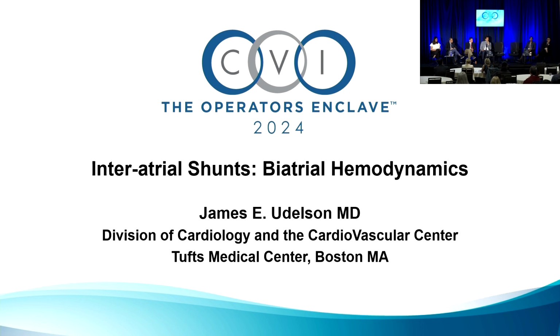Yeah, thanks so much for asking me an interventional question, Navin. I really appreciate that. So I assume, I don't know, but I assume in those other procedures that it's actually a very small hole that has been created. Is that correct? Yeah, so for example, with MitraClip, they're on the range of around 20. So they range between 18 to 22 French, let's say. Millimeters in the range of about 4 to 6 millimeters, as I recall, something like that.